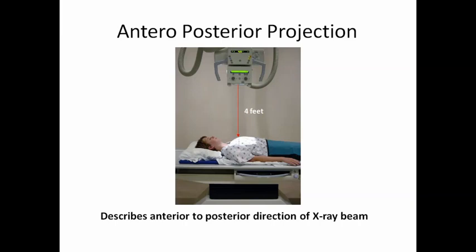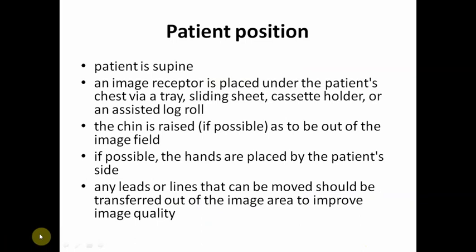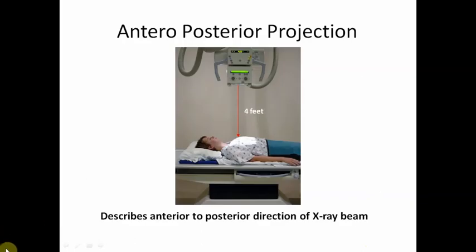Okay, mid see, there is a marker here. I am not able to get the marker. I think next class I'll explain you people how mid sagittal should be perpendicular, how the coronal should be perpendicular.